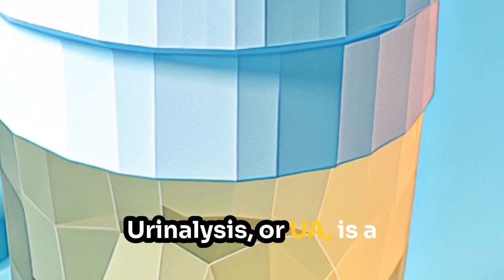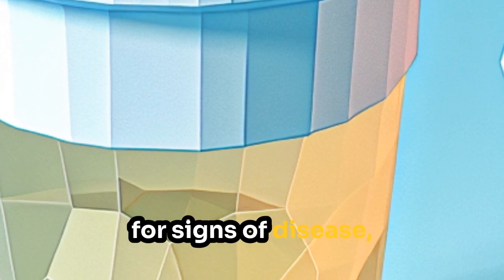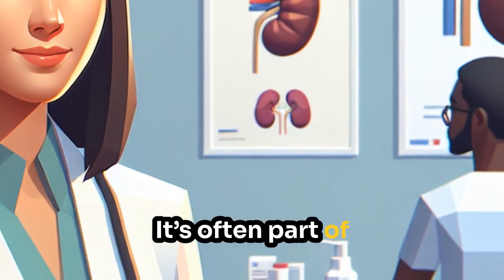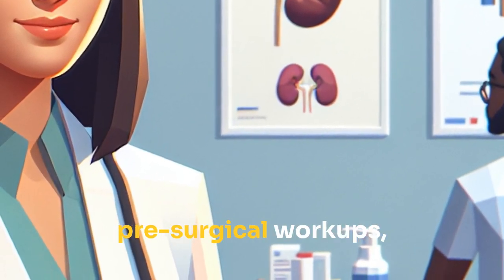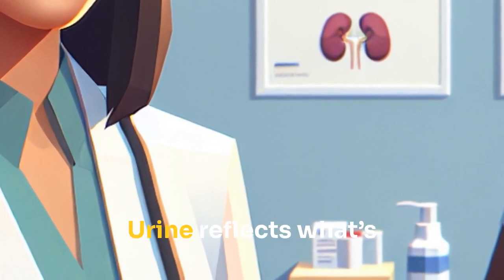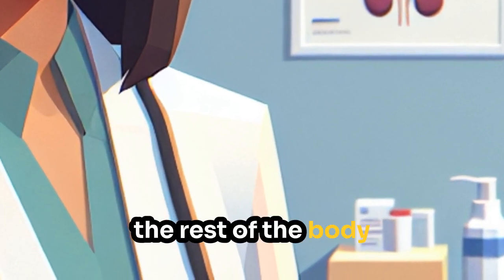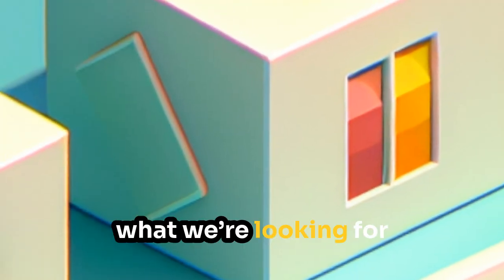Urinalysis, or UA, is a quick, inexpensive, and non-invasive test that examines urine for signs of disease, hydration, infection, or metabolic issues. It's often part of routine checkups, pre-surgical workups, or diagnostic testing when symptoms arise. Urine reflects what's going on in the kidneys, liver, and even the rest of the body. Let's break down what we're looking for.